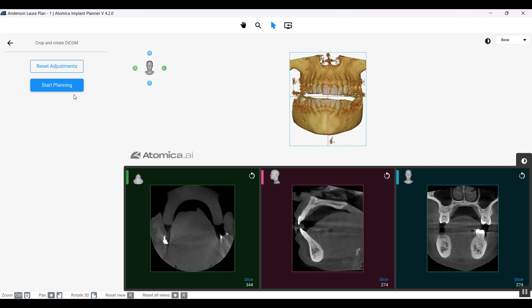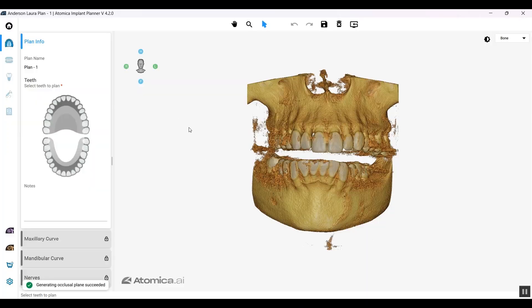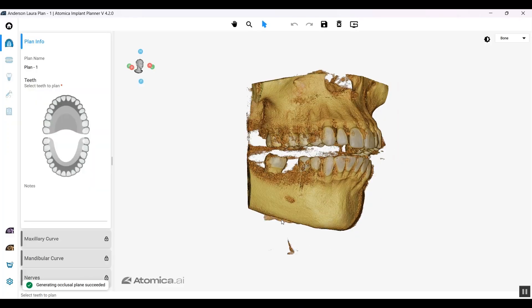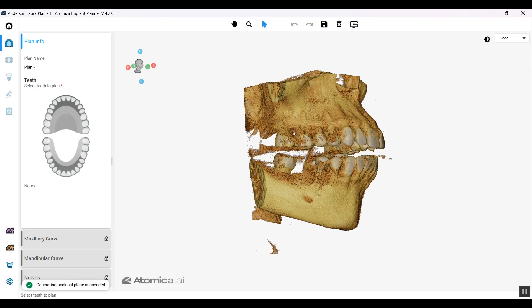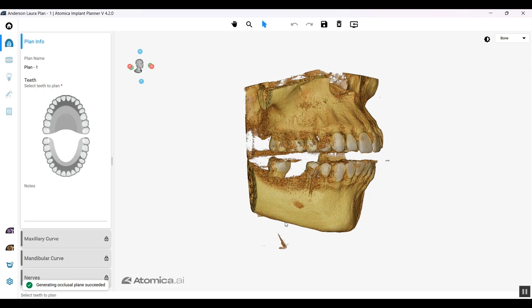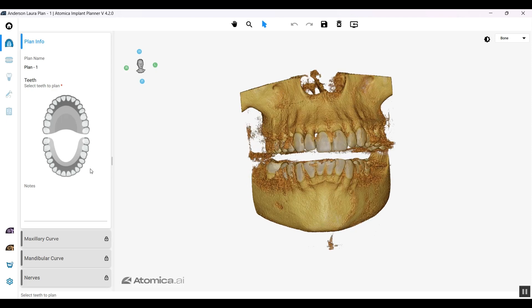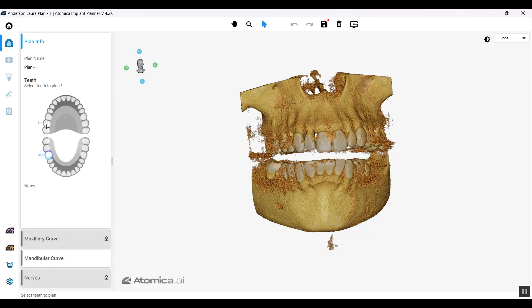Let's go ahead and tap on Start Planning. We have a missing lower right six, tooth number 30. As soon as I selected the tooth on the lower arch, the mandibular curve turns on. If I did that on the upper arch, the maxillary curve would turn on, but we're only concerned with the lower arch, so we're going to continue with it.